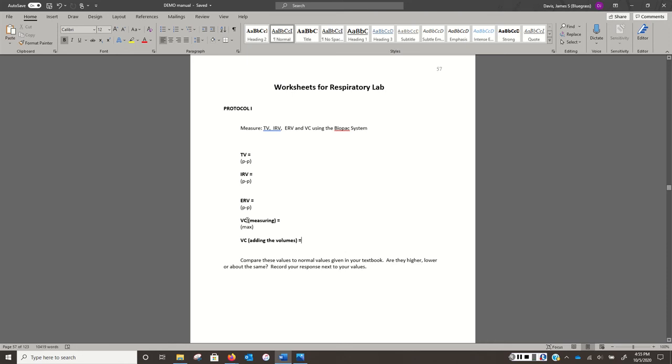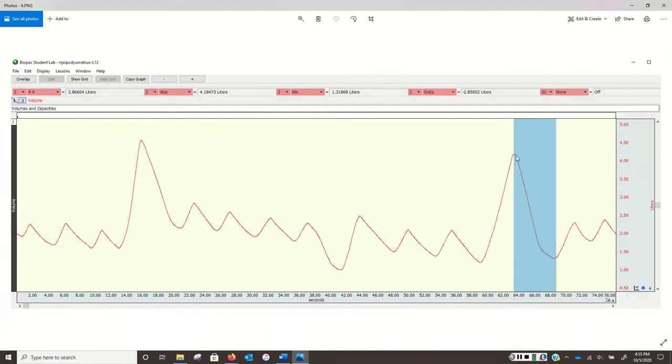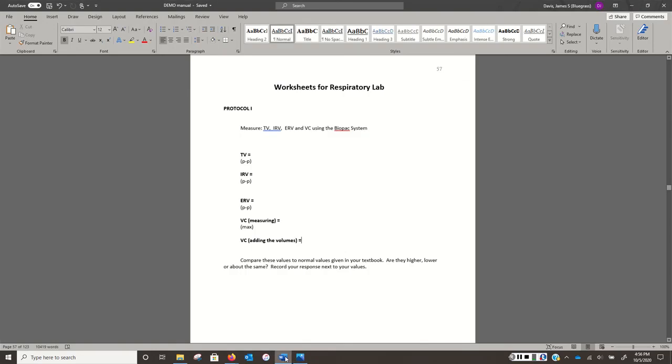But then we could also use the spirometer to measure vital capacity. And that's what I've done here, measuring peak to peak, but we're measuring the maximum. So from here to here, instead of looking at the peak to peak area, we're looking at the max right here. So my max, 4,185 milliliters. And if we compare that to the vital capacity that we got from adding, they're not exact, but they are pretty close. That's because we measured at different points. So that's the first part. That's protocol 1 is what we were doing there.